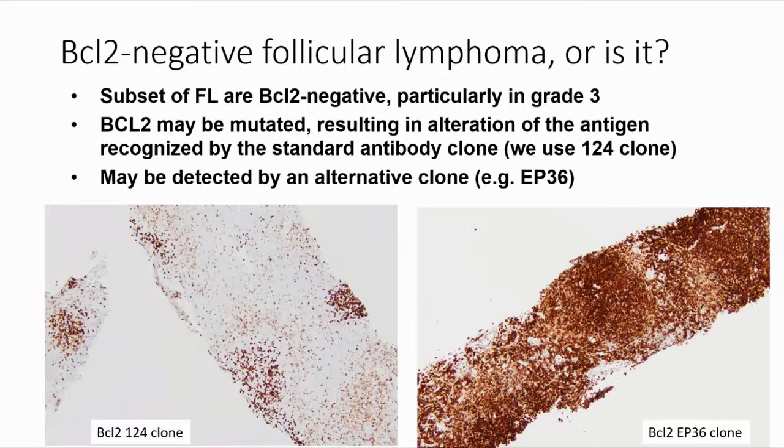There is another question: can we have something which is intermediate between classic follicular lymphoma and the diffuse variant of follicular lymphoma? Oftentimes you will see both follicular and diffuse areas, in which case the phenotype, and there could be more published on this, often more resembles that of the classic follicular lymphoma when you see both of those parts.